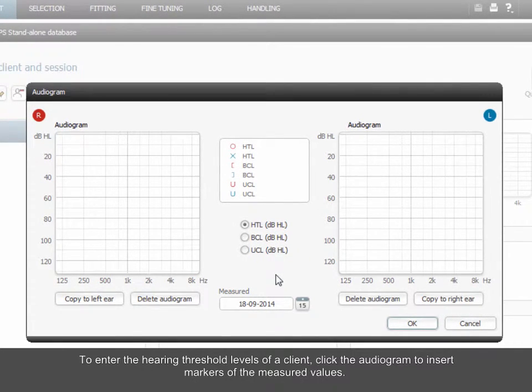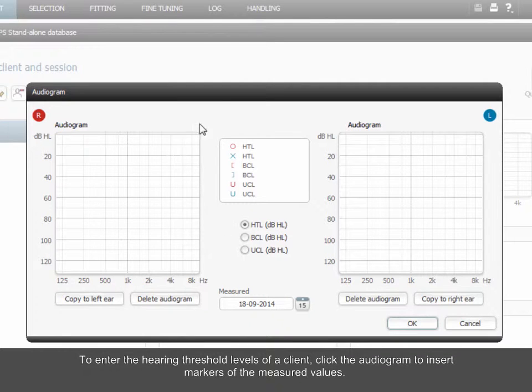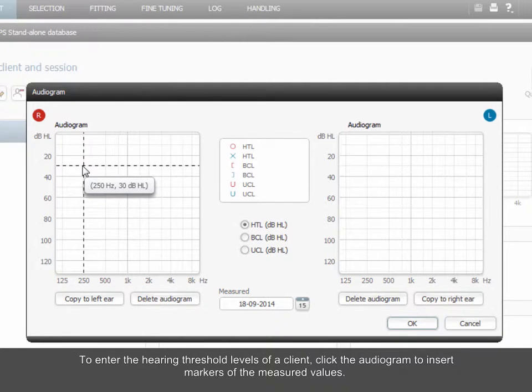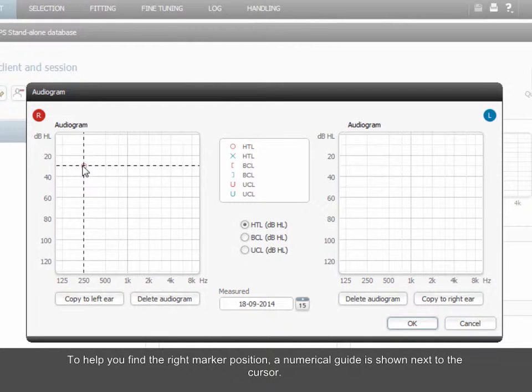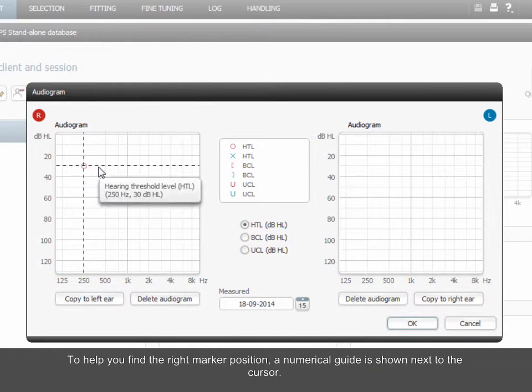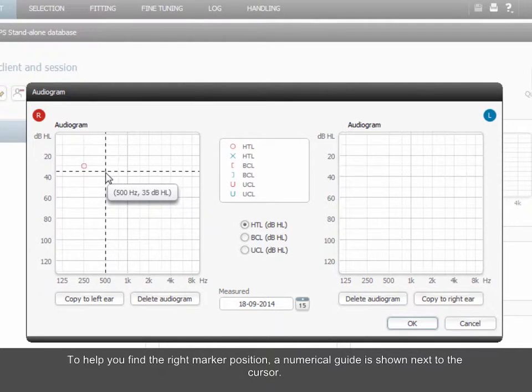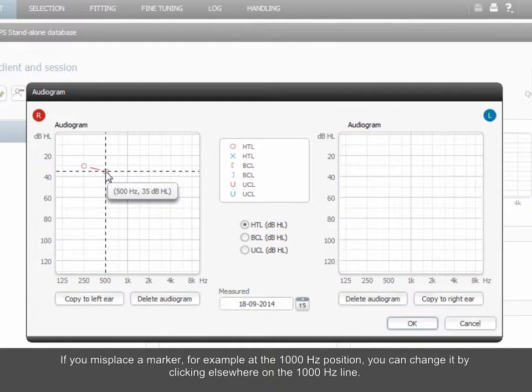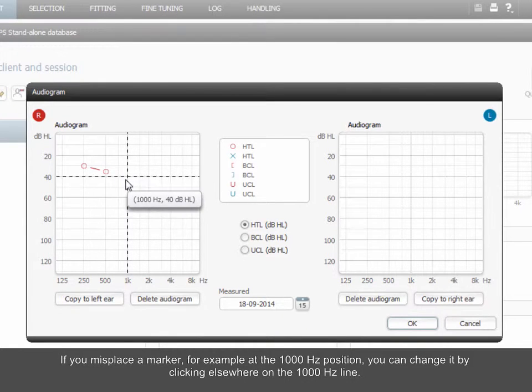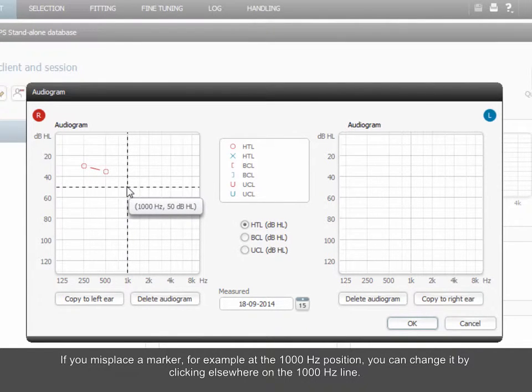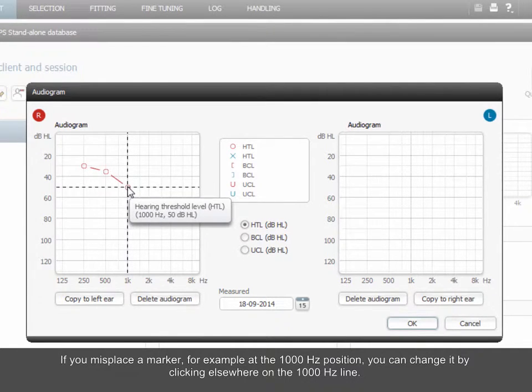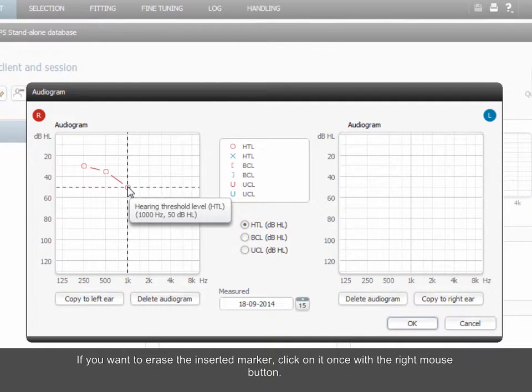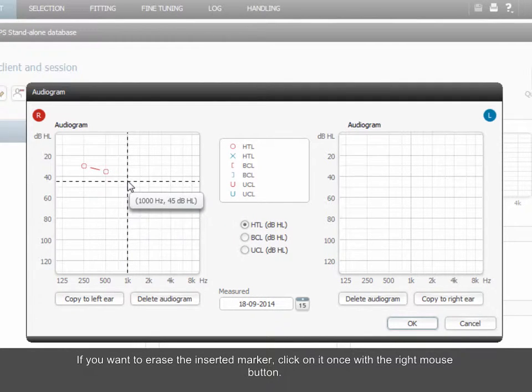To enter the hearing threshold levels of a client, click the audiogram to insert markers of the measured values. To help you find the right marker position, a numerical guide is shown next to the cursor. If you misplace a marker, for example at the 1000 Hz position, you can change it by clicking elsewhere on the 1000 Hz line. If you want to erase the inserted marker, click on it once with the right mouse button.